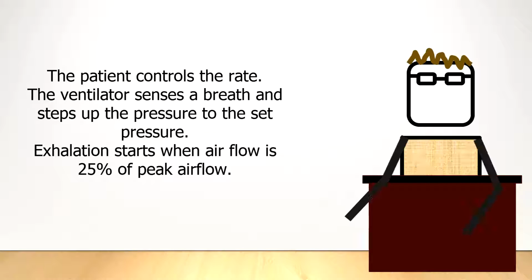When the patient initiates the breath, the ventilator only steps up the pressure from the PEEP level to a preset pressure that the operator had predetermined. This pressure remains elevated until the patient decides to start exhalation.